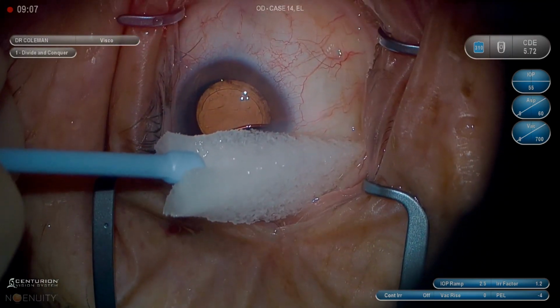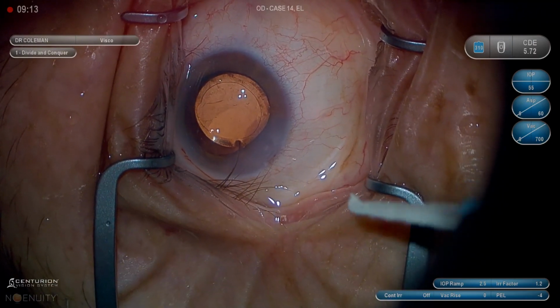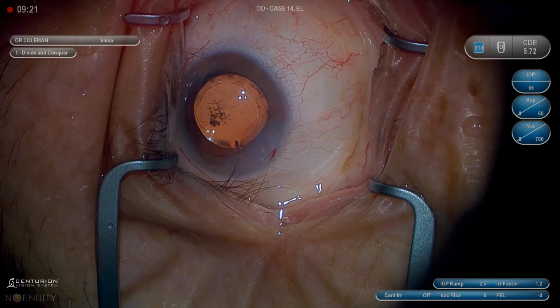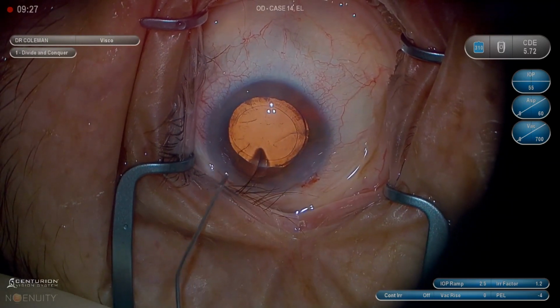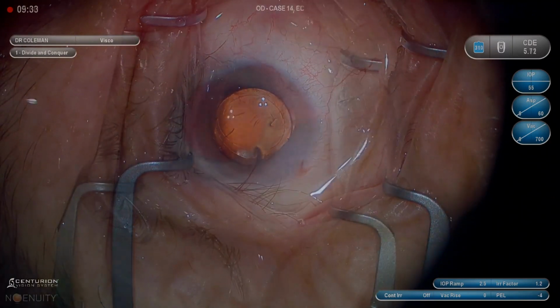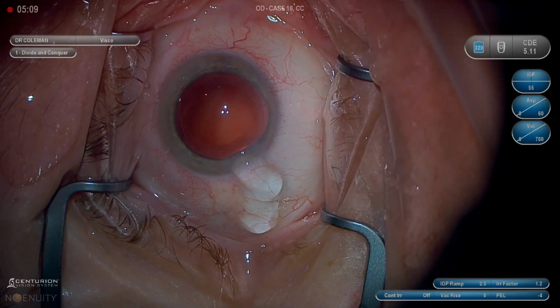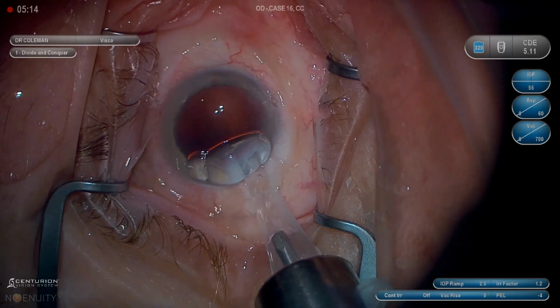So now to hydration of the wounds. When I'm thinking about hydrating a wound, I'm thinking about the distance from the inner to the outer portion of the wound, and I want to basically divide that in half. So let's say the main wound is 2.5 millimeters long. I'm going at a point about 1.25 millimeters, halfway, and I want to be as perpendicular as possible to the direction of the main wound. I want to place the tip of my cannula at that point, half the distance between the inner and the outer edges of the wound.